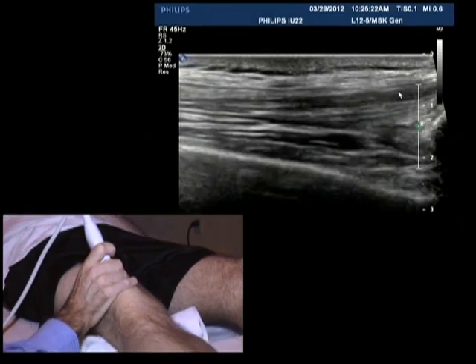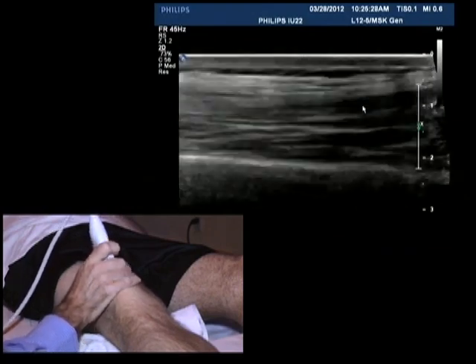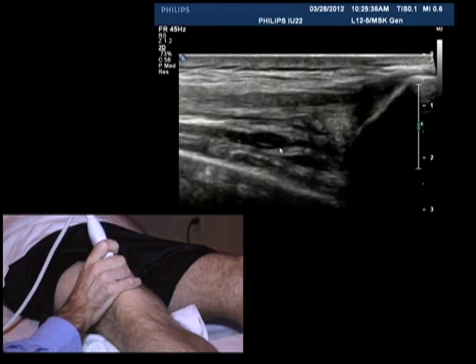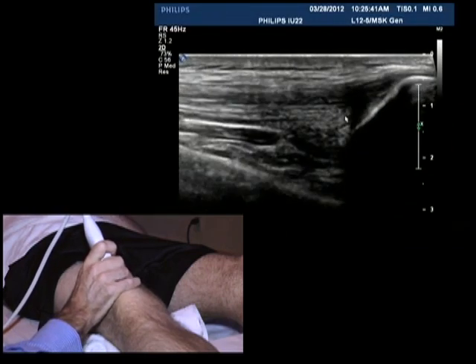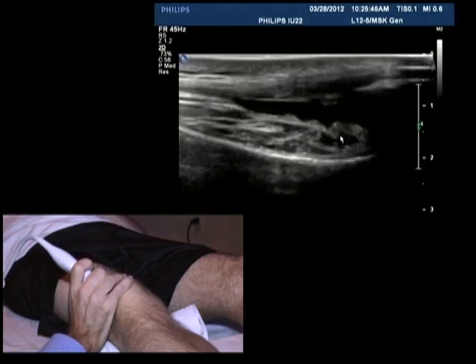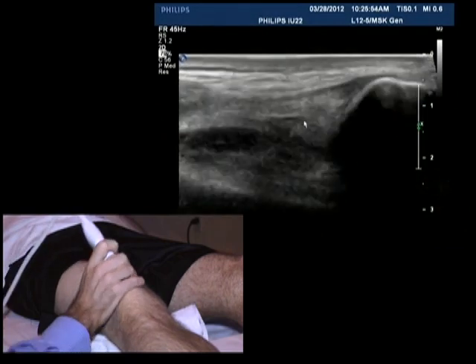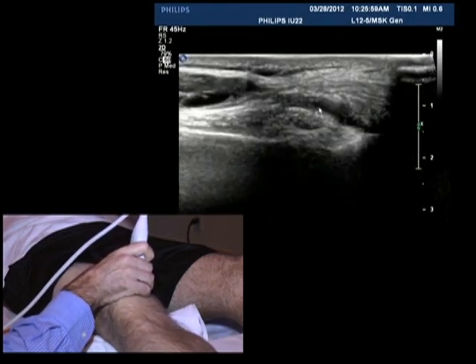So that's longitudinal. So let's just recap: patella, quadriceps tendon, anterior distal femoral cortex, prefemoral fat or packing fat, if you like, over the distal femur, suprapatellar fat pad, really minimal to no fluid in this patient's knee joint. A tiny bit of fluid, actually, if we come at the lateral margin of the knee. See it? So that's normal. Come over on the medial side, a little bit of fluid on the medial side. So that's normal.